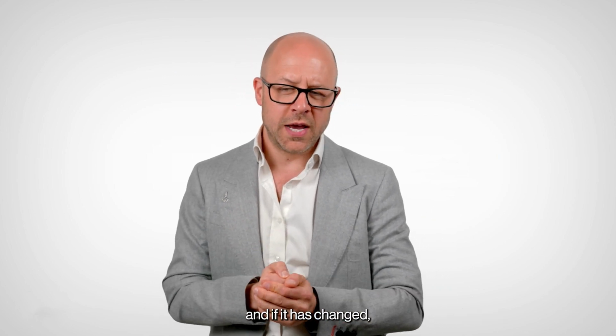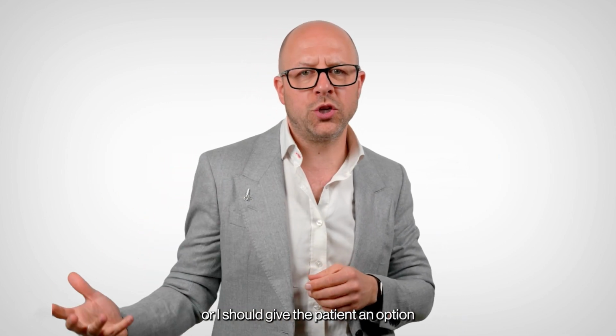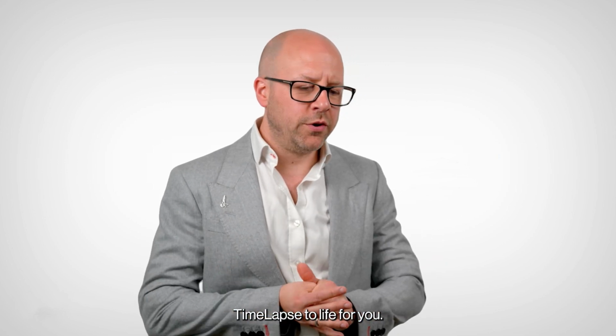And if it has changed, that gives me evidence and facts that I should take an intervention, or I should give the patient an option where they can have an intervention. Let me tell you a little story that'll hopefully bring time-lapse to life for you.